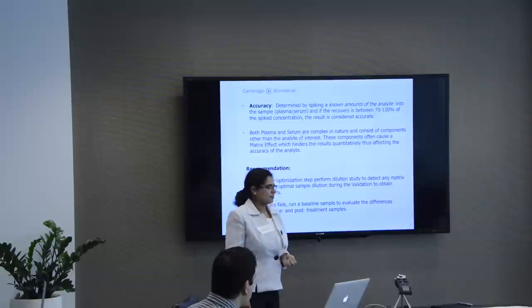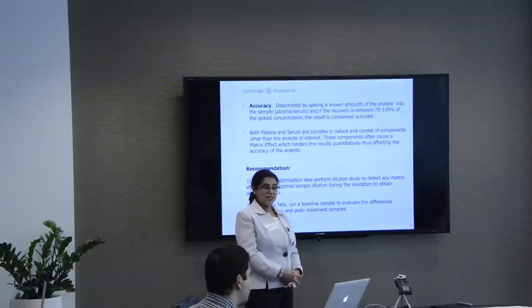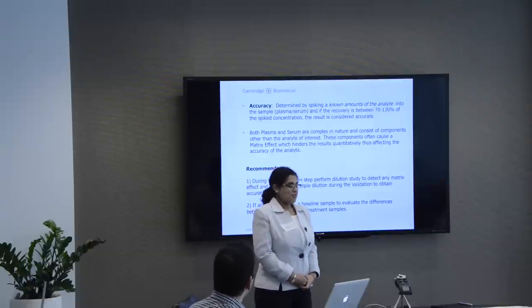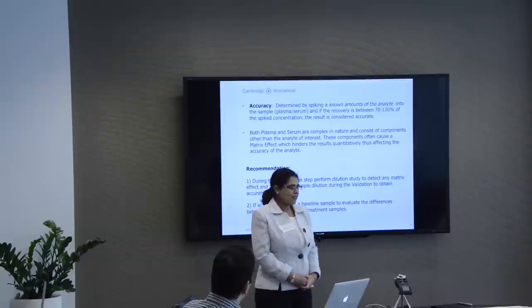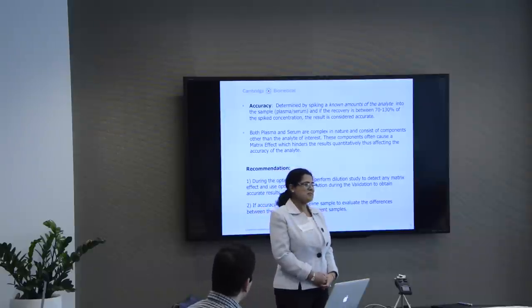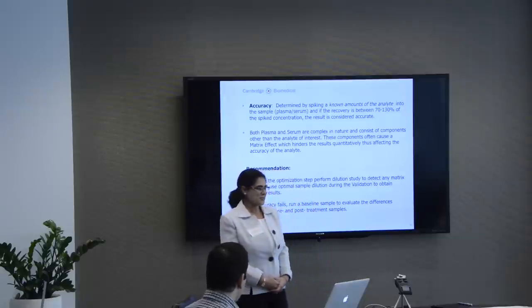So if you dilute, I know for some analytes you have to dilute 1 to 20 to remove the matrix effect. But then, this is the whole thing. FDA says, when you are validating an assay or testing the assay, you should have at least 90% of your matrix. You have 1 to 20 dilution, you don't have that 90% matrix in there. Yeah, you'll get an accurate result, but not with the matrix.